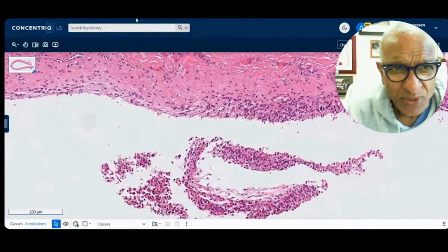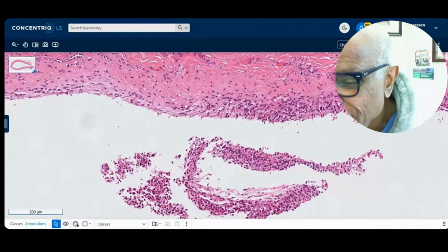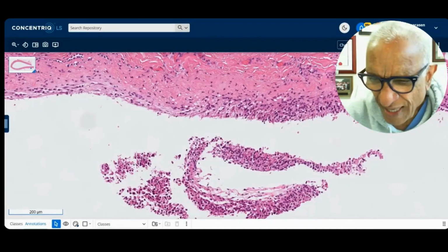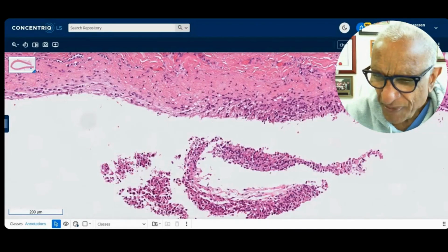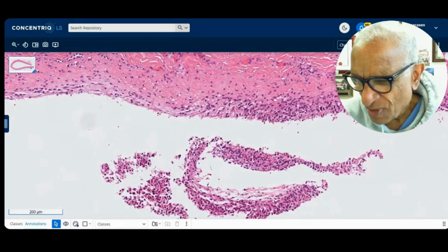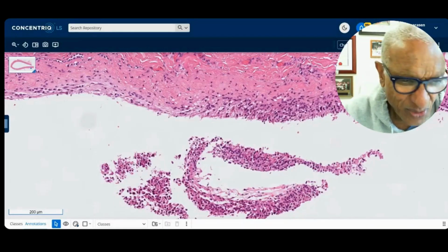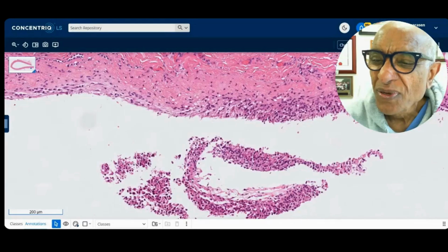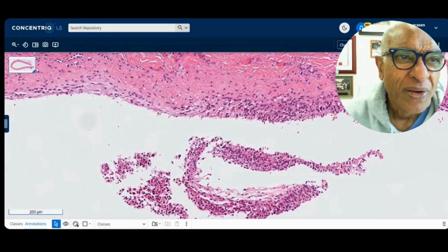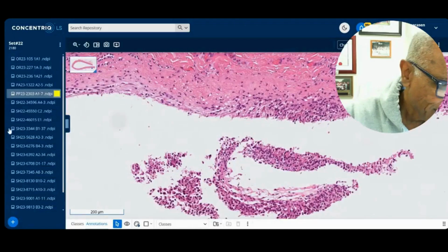Okay, any questions or comments on that? Solomon, unstable network. What is the answer, please? I'm going to defer to Ava Solomon to help you with that. I must confess I'm computer illiterate, and I'm just so grateful that this system is working with scanned slides and being able to communicate with you all. So, all right, let's move on to another case.